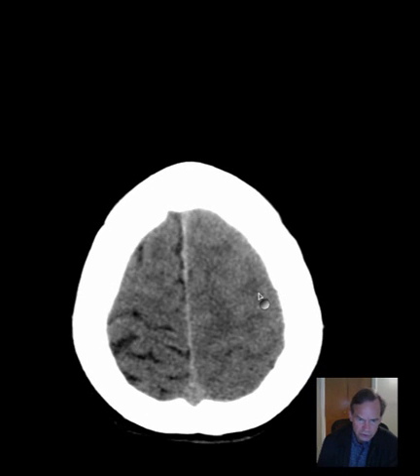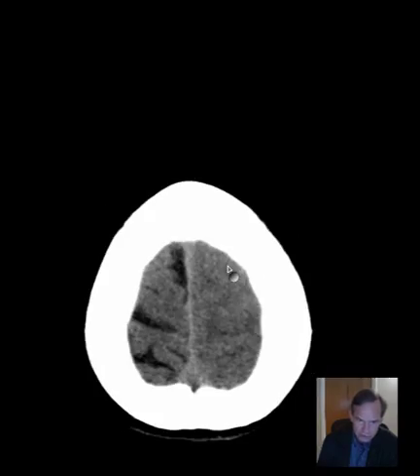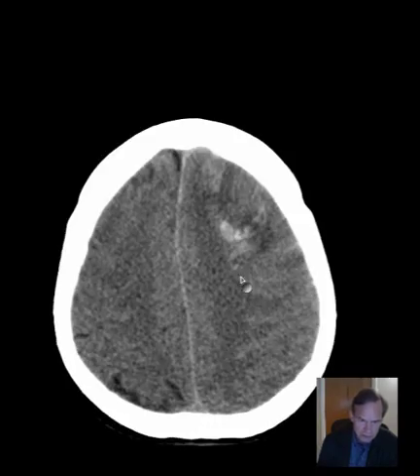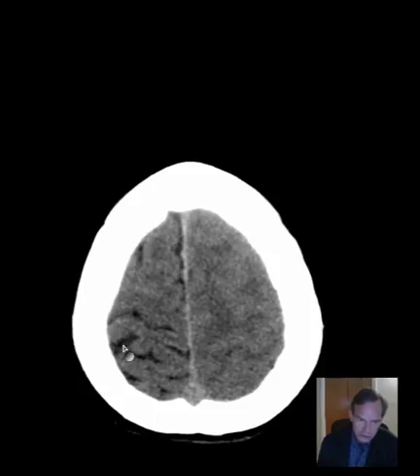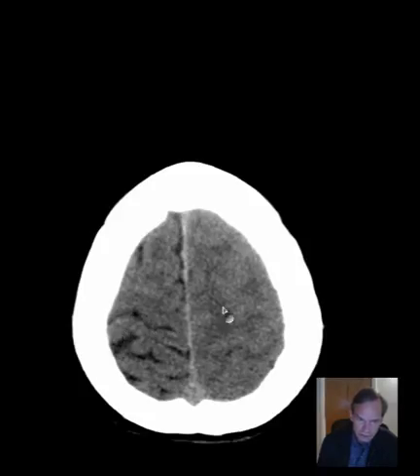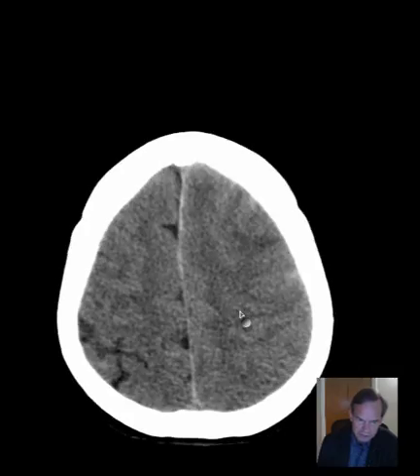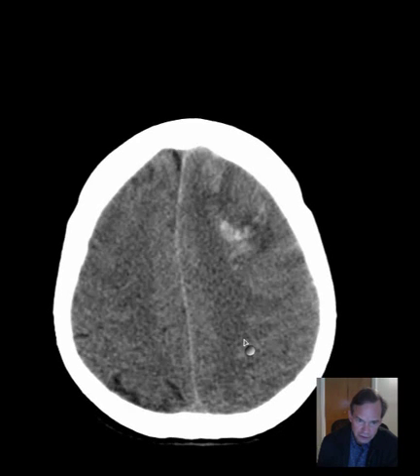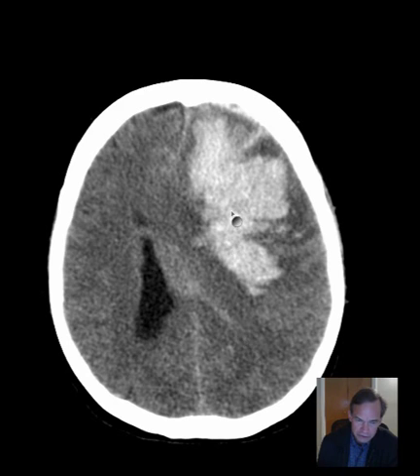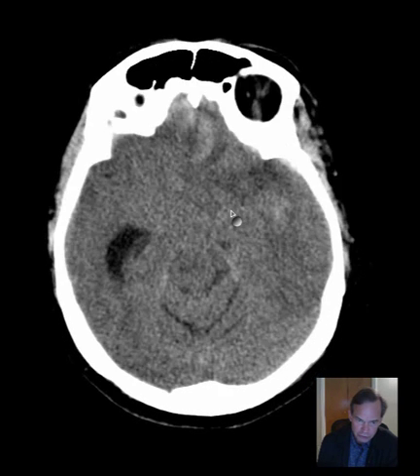You can also see that there is mass effect, and this is what we call sulcal effacement. The left cerebral hemisphere has loss of the sulci. On the right, we have nice sulcal markings — the sulci are visible — whereas on the left, because of mass effect, these sulci are effaced, and you see little or nothing of them, because of this massive mass effect in the left cerebral hemisphere.